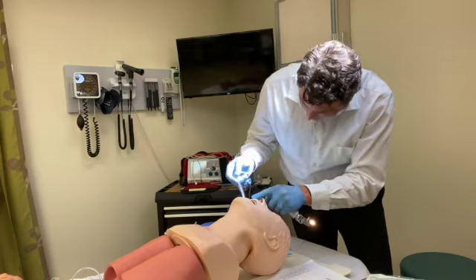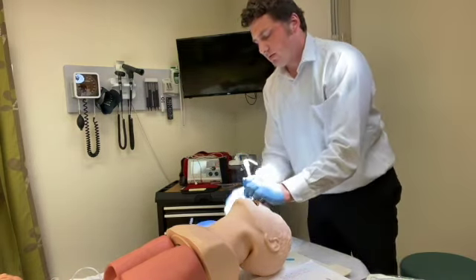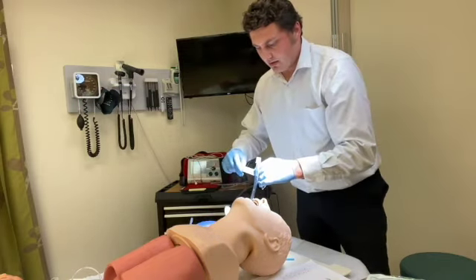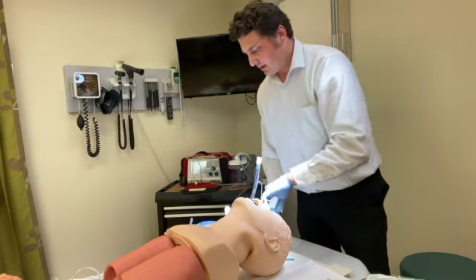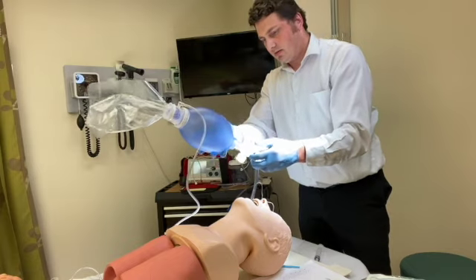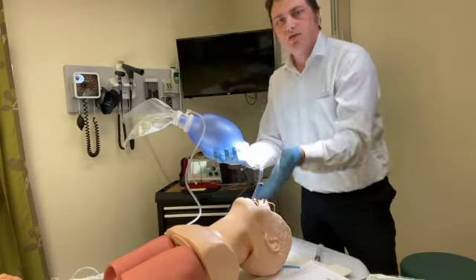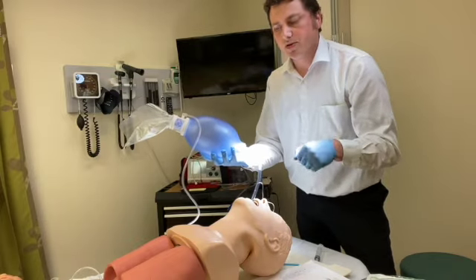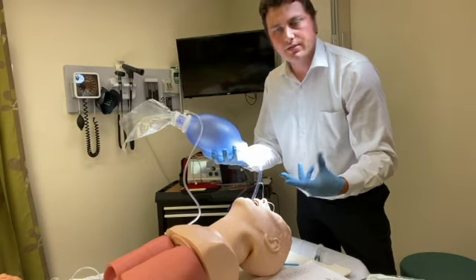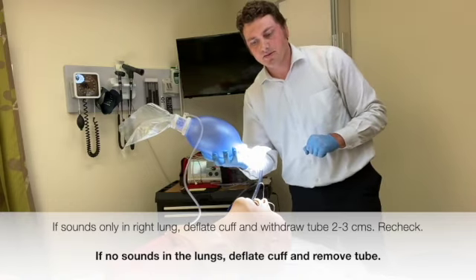Typical spot about 20 centimeters right at the lip. Okay. Remove the stylet. Add air into the syringe. And now use the bag valve mask into it. And you see bilateral expansion of the lungs. Obviously you wouldn't see an actual chest cavity, so you want to listen to both lungs, making sure that you hear sounds in both the right and left lung, and then also check the stomach to make sure that you didn't accidentally get into the esophagus.